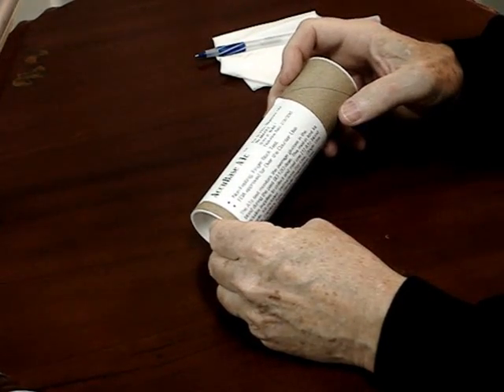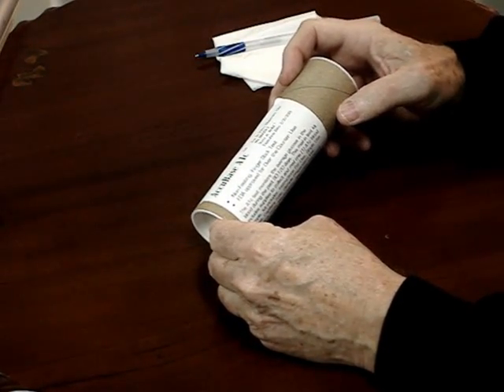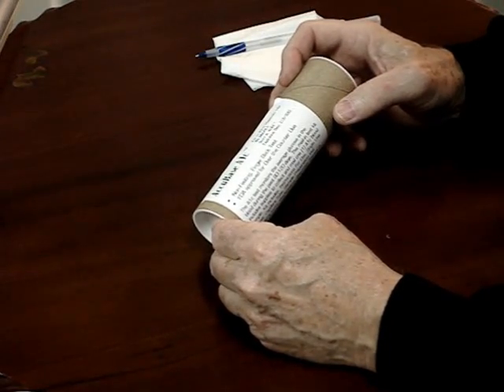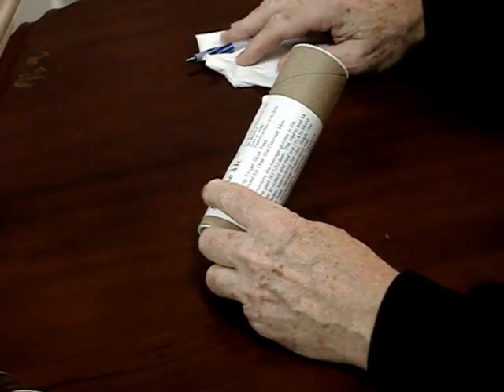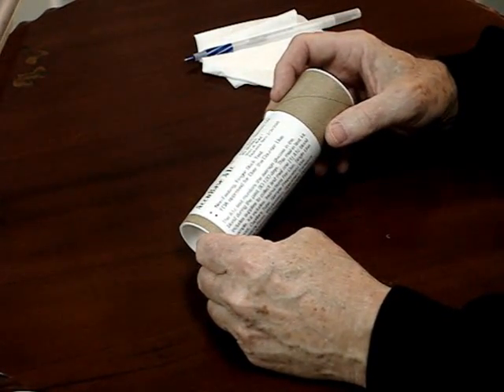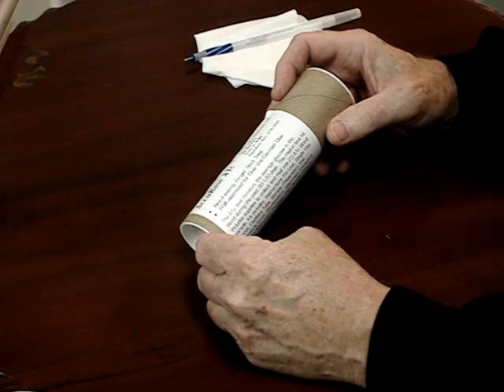Welcome to a video demonstration of the AccuBase A1c test kit. Before you begin the collection of your A1c sample, you will need a Kleenex tissue and writing pen. After you have viewed this video, take time to read the instructions for use.